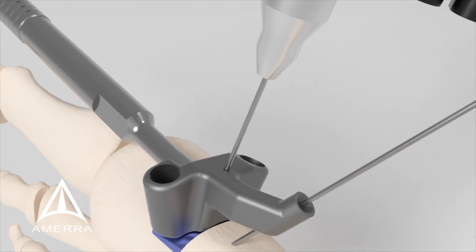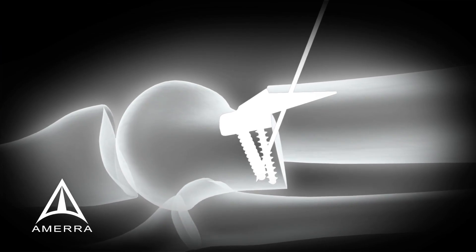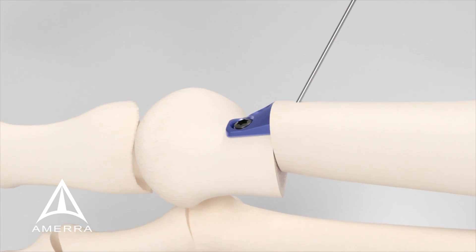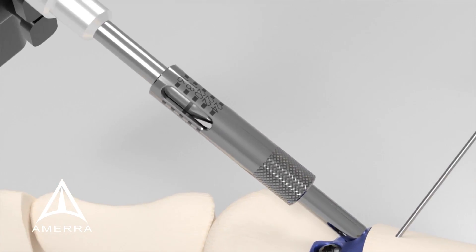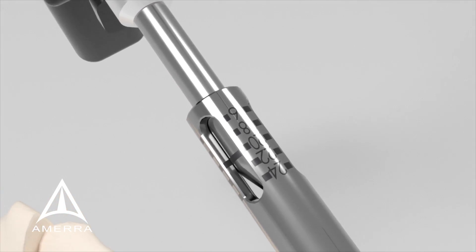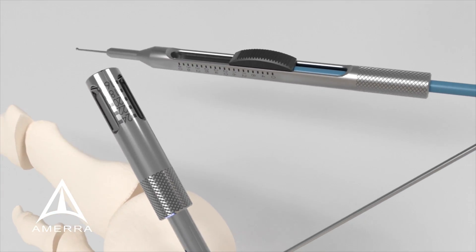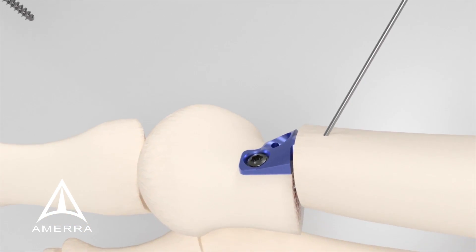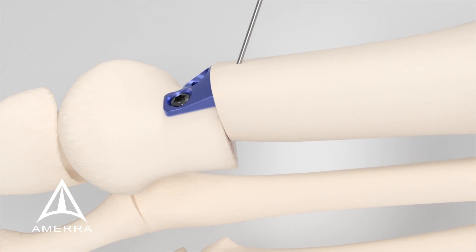Remove the distal placement K wire and remove the plate placement guide assembly by sliding it back over the remaining proximal placement K wire. Insert the interfrag drill guide into the remaining plate screw hole and pilot drill for an interfrag screw. Utilize the calibrations on the interfrag drill guide and calibrated drill bit or the depth gauge to determine the necessary screw length. Remove the interfrag drill guide and insert an appropriate length solid core non-locking screw into the pilot hole using the driver bit.